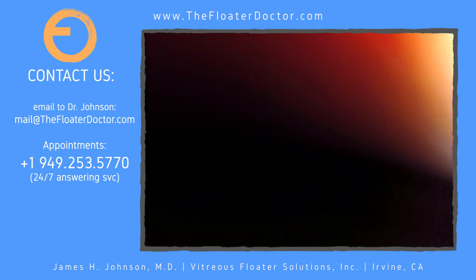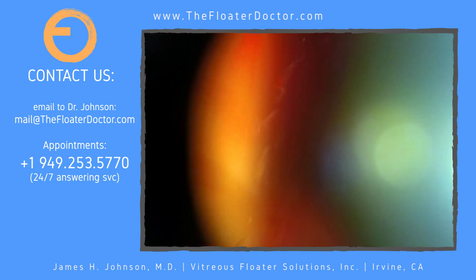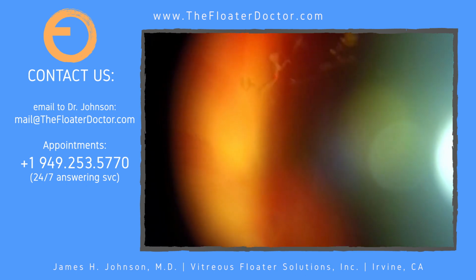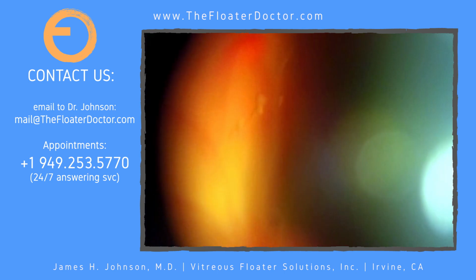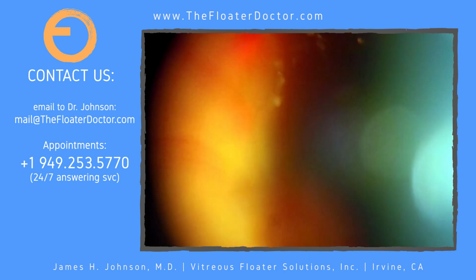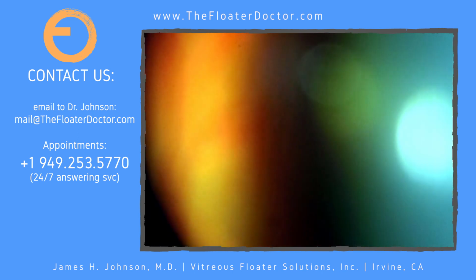Do that again, look all the way down, this time way up high, back down again, back to light here. Down, and then back to light. We'll make you work for it a little bit.